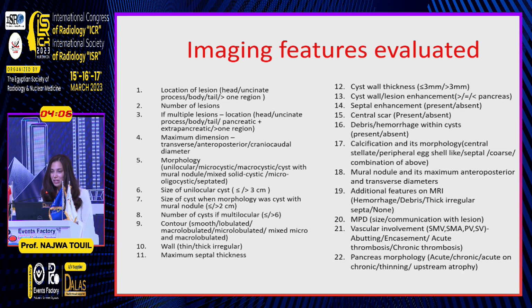We evaluated all the imaging features. As you see, about 22 imaging features were evaluated. The morphological features incorporated the classification proposed by Sahani et al.